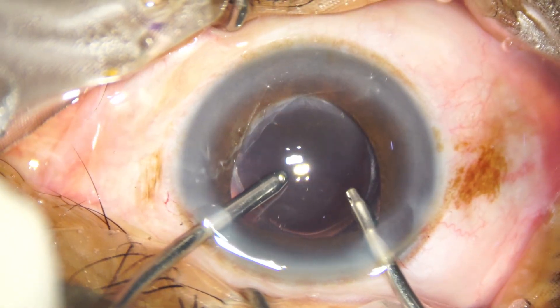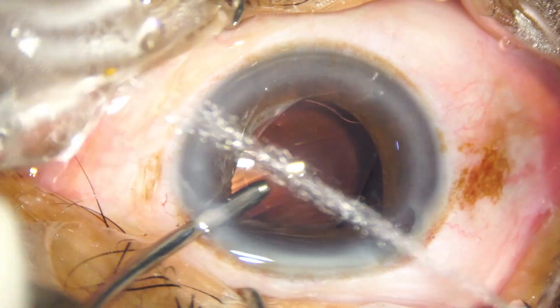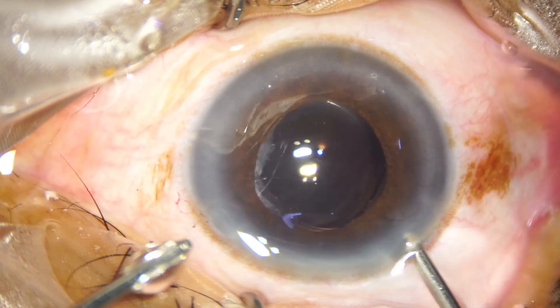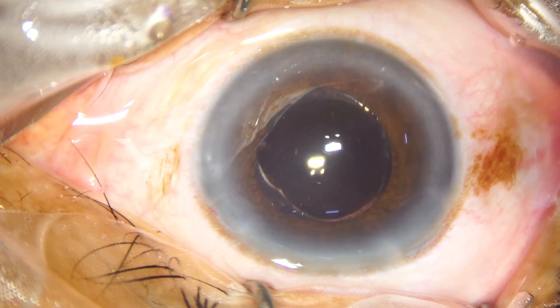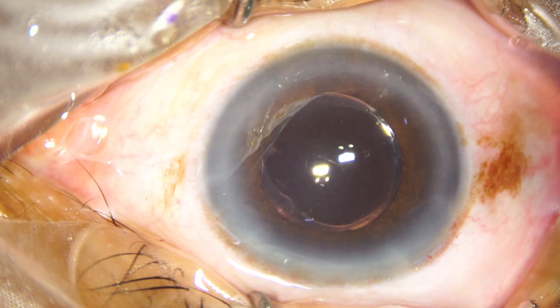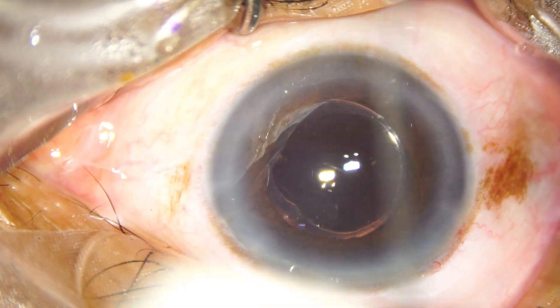Now watch: as I come out after a thorough cleaning, the iris gets incarcerated in the main wound. In floppy iris, always check that no part of the iris gets incarcerated at the main wound or at the side port at the conclusion of the surgery.